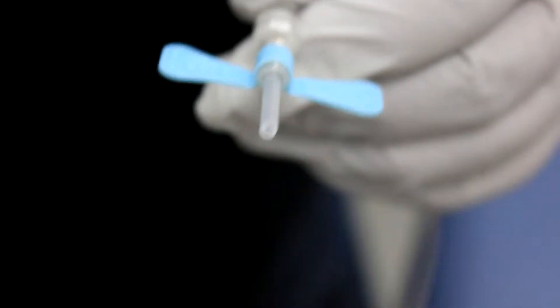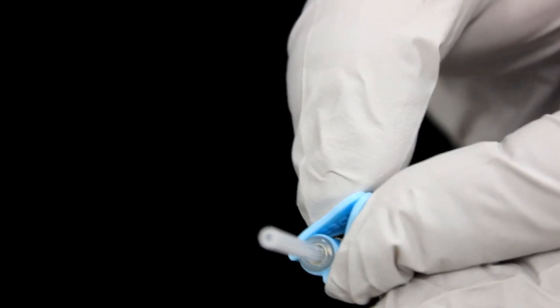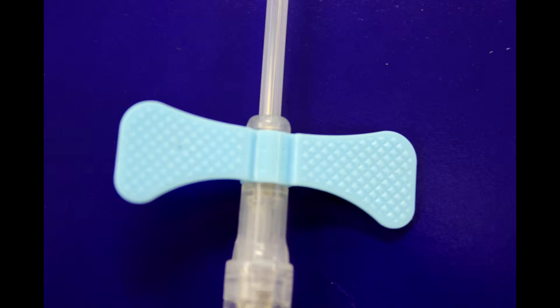After setting up your collection device, grip the wings together for stability during the draw. Note that the back of the grips are textured and will prevent slippage with your gloves.